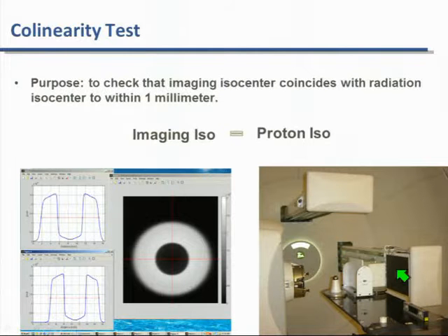So this is something that's easy, is done on a monthly basis, or whenever somebody says, hey, I banged one of our RTTs against this, or it didn't extend well, or you suspect that there is divergence. Very easy test, with very easy equipment to set up.